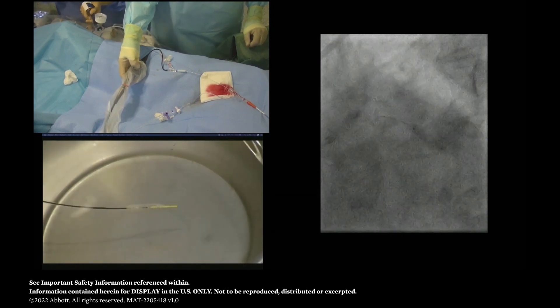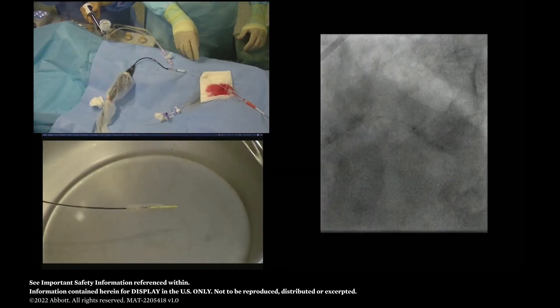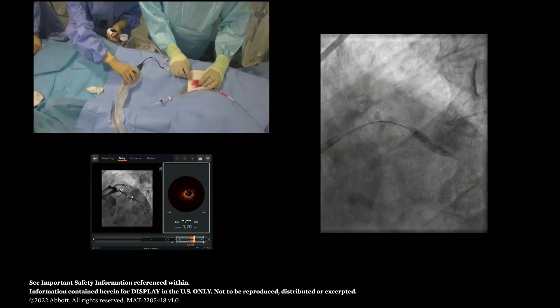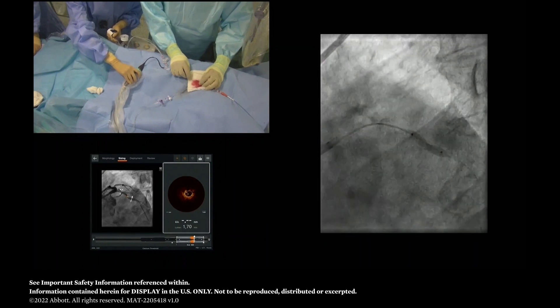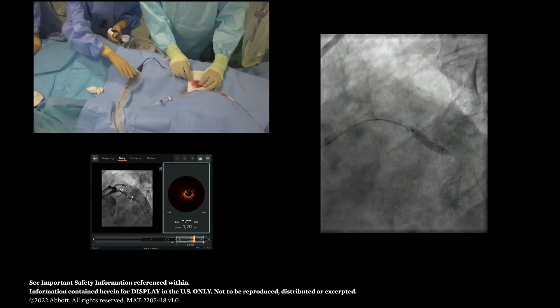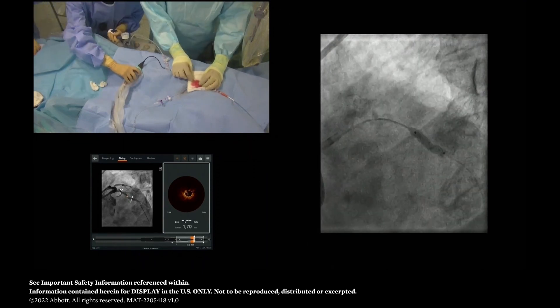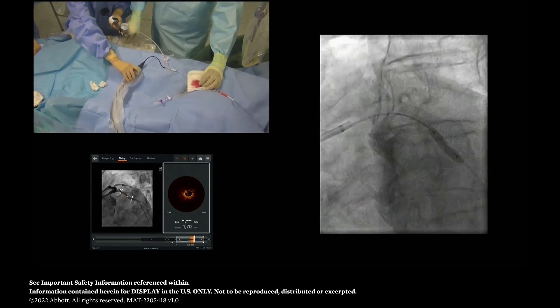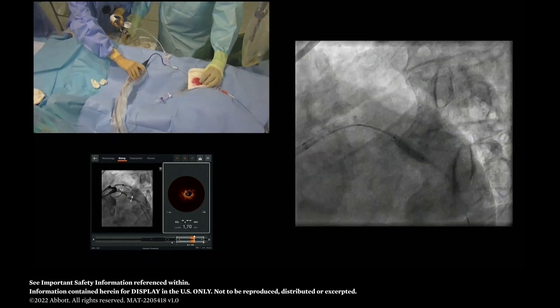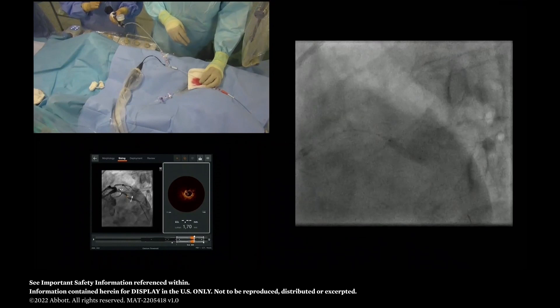We deflate now. It improved already from the first shocks. You can see it improving, and you can see the generation of CO2 bubbles inside the balloon as a consequence of the sparks. It looks definitely better — it looks very good already. This is very good news because then we can go directly to stent expansion without further predilation.